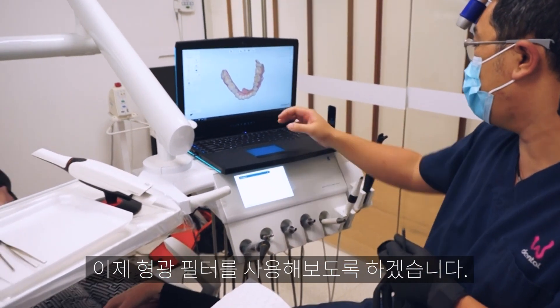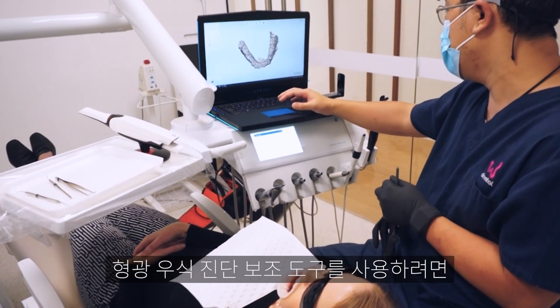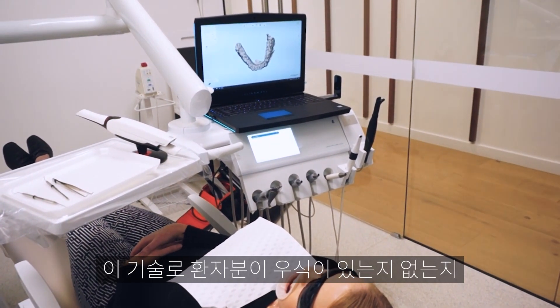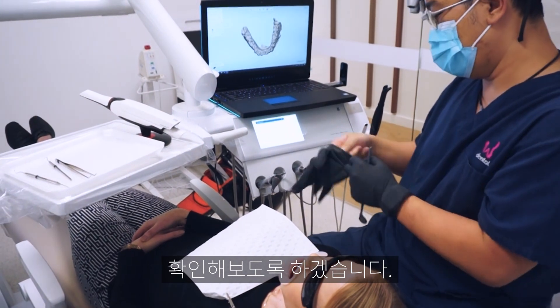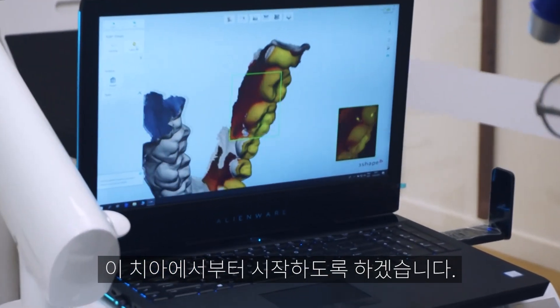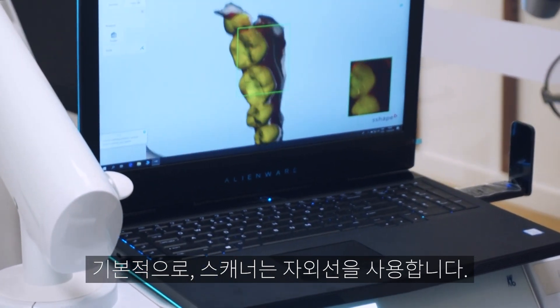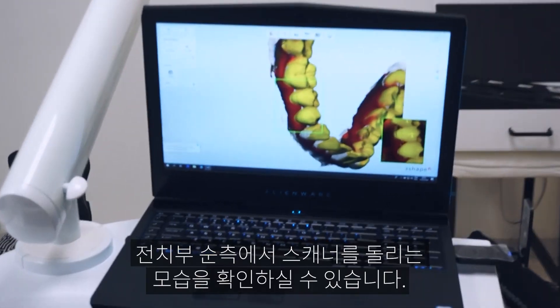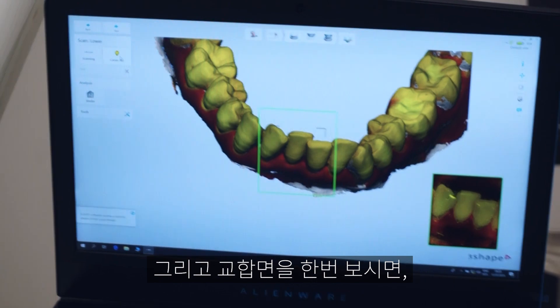Now we're going to try the fluorescence filter — the fluorescence aid, or caries aid. We're basically going to scan over the existing teeth and see whether Naomi has any caries or not.